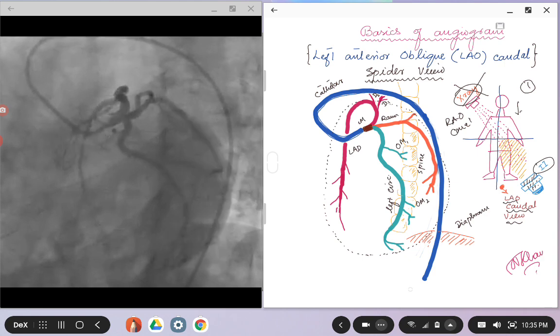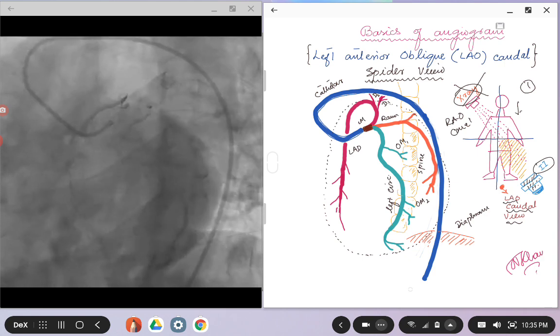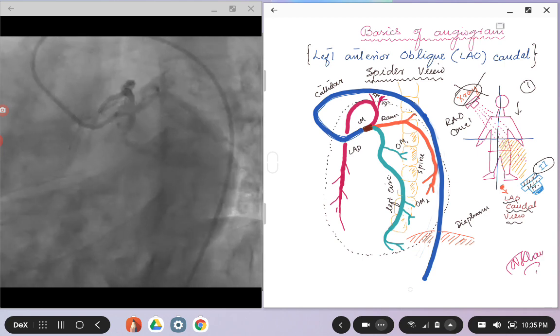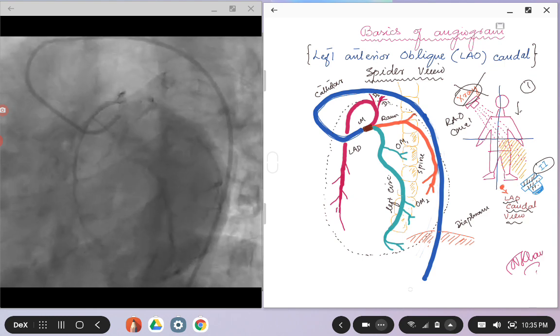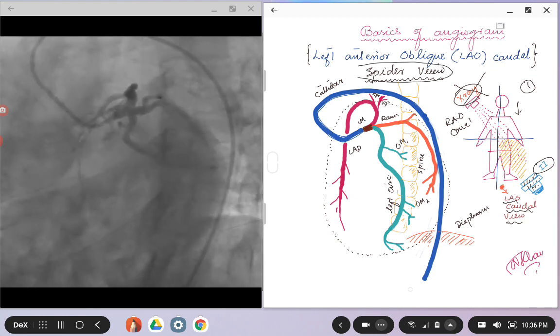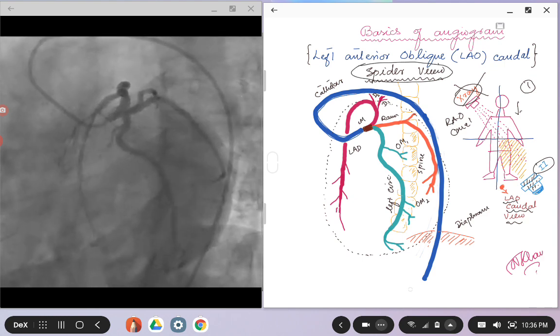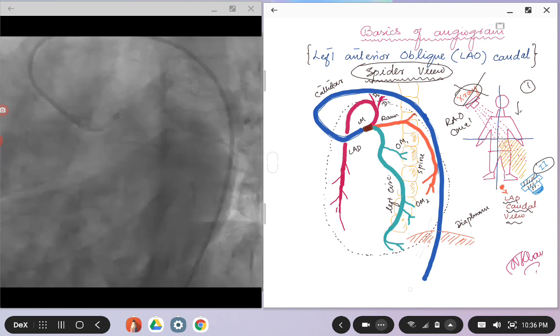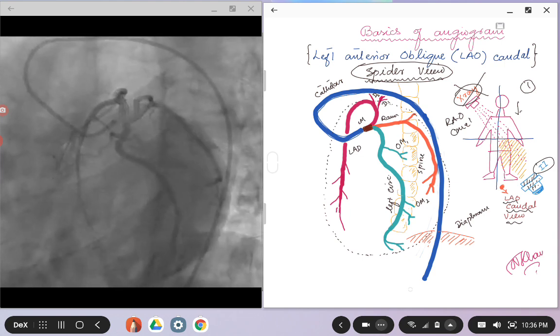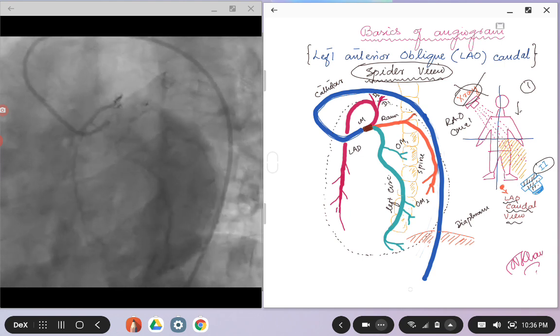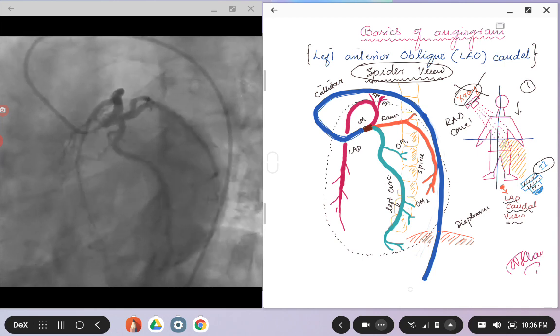On your left there is a cine image of a LAO caudal view. It is also known as a spider view, just as the coronary arteries look like the legs of the spider. So in layman terms, we sometimes call it a spider view.